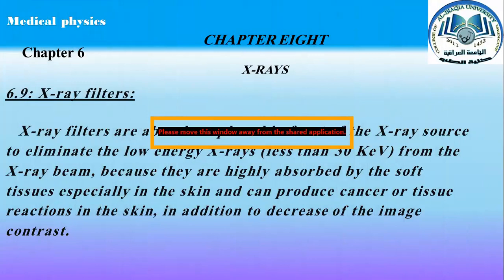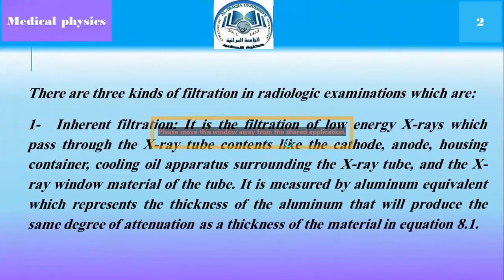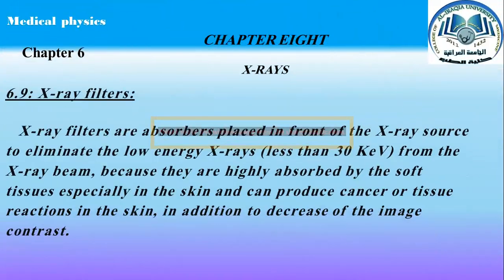X-ray filters. When producing an X-ray beam, there are many X-ray photons with different energies. Some of this energy can be harmful to the body, to the patient, or can affect image contrast. That's why we use X-ray filters.